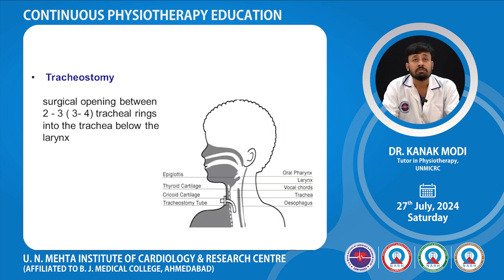What is a tracheostomy? It is a surgical opening between the second and third tracheal ring into the trachea below the larynx. We can see in the figure, the tracheostomy tube is inserted just below the cricoid cartilage.